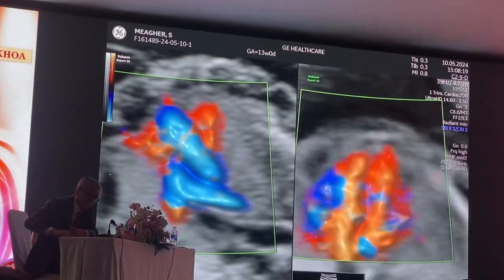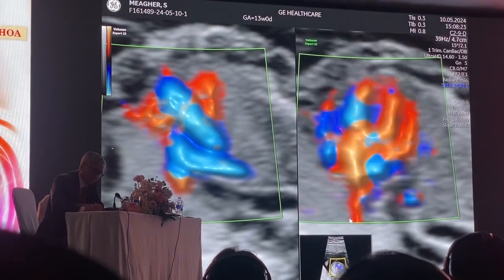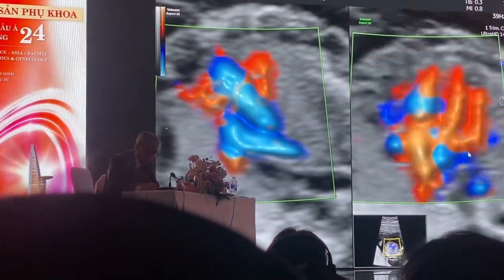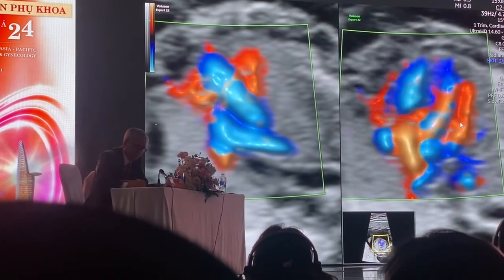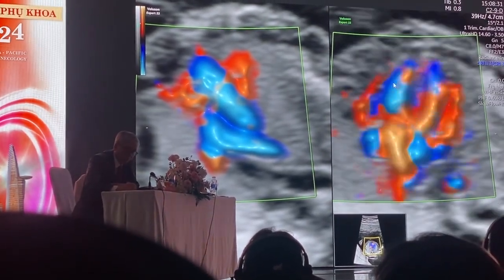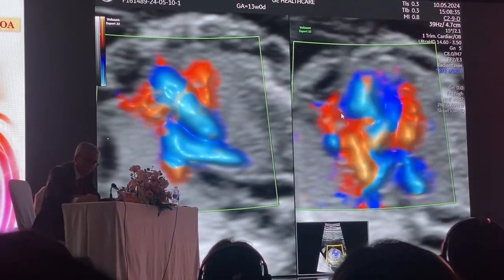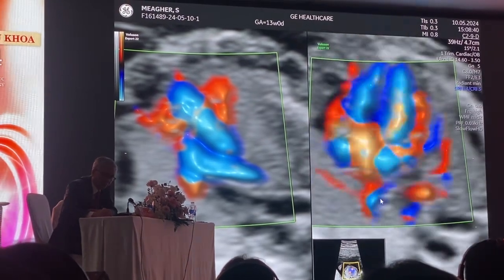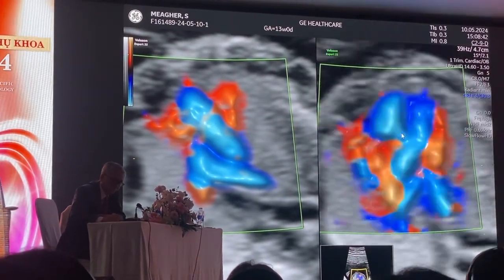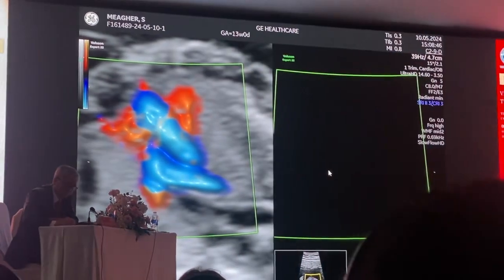Anyway, the other things I wanted to show you, and maybe we'll show you in the next patient depending on the position, but I want you to look at the atrial appendages. So you're coming down either side, you see the atrial appendages, they're still quite a size. This here is the left ventricle, the left atrial appendage, the right atrial appendage, which you can see extends right down the full length of the heart. You can see the branch pulmonary arteries, the branch pulmonary veins, the interventricular septum, and then you can follow down the intrahepatic venous anatomy. I better stop there.